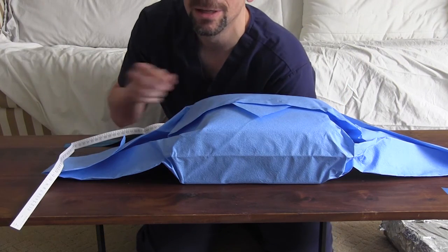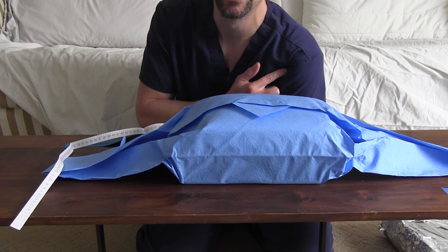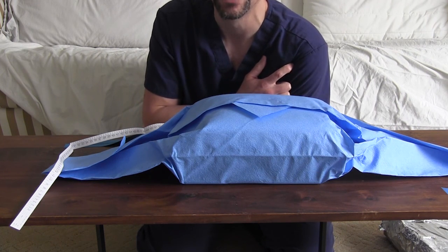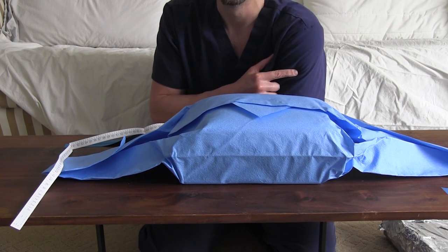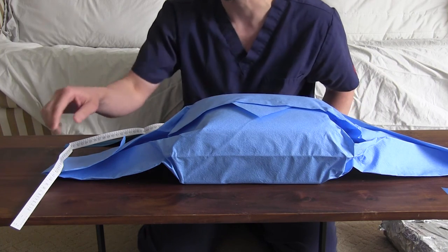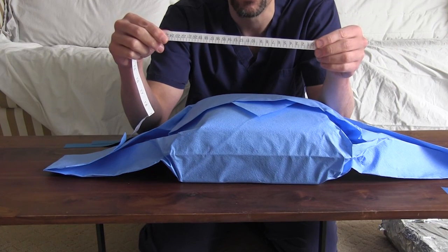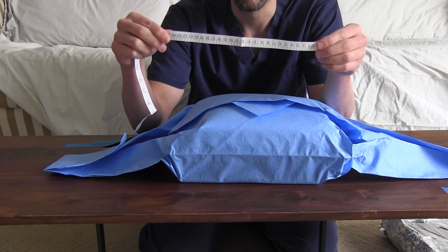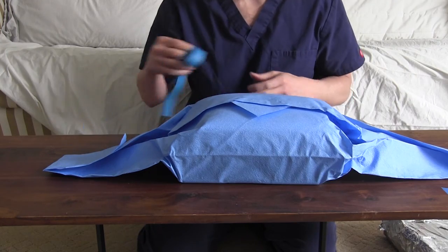Now for us, we were doing it right to the crease of the arm, and we had some situations where in the last couple of centimeters, it wouldn't quite advance. And so now we've taken to just going like 2 centimeters below the crease of the arm, and we've had better success with that. So we always measure with the centimeter side of the ruler from the insertion site to that point, a couple centimeters from the arm crease, and we've had good luck with that. So find out what that number is after you pick the site you're going to cannulate.